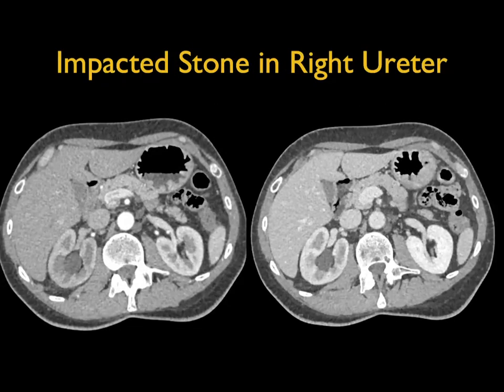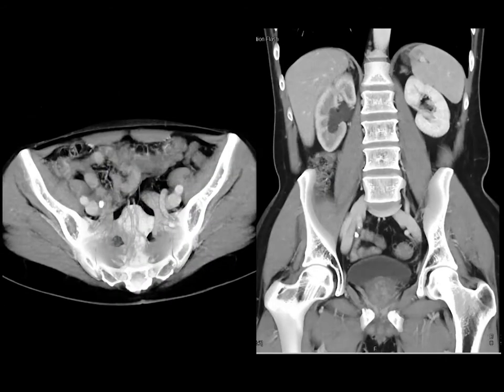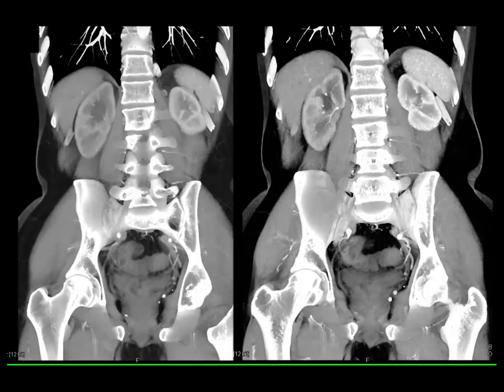Another example you can see in this patient: dilated right renal pelvis, differential flow in the right and left kidney, and then as you track downward, you see evidence of a stone nicely shown in the patient's right ureter. And again, the coronal views nicely show you the hydronephrosis and the differential function right to left. Sometimes you may not see a stone, but you see the ureter. And sometimes you don't see the ureter, but you see the changes in perfusion of the kidney. All of those are important signs and can be helpful. And again, here's just an example on a later phase with the stone in place.